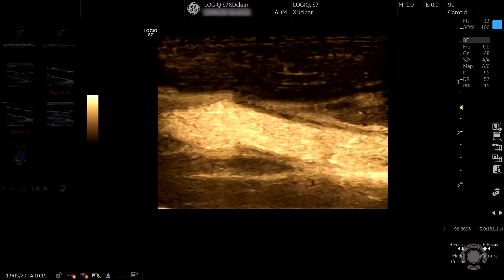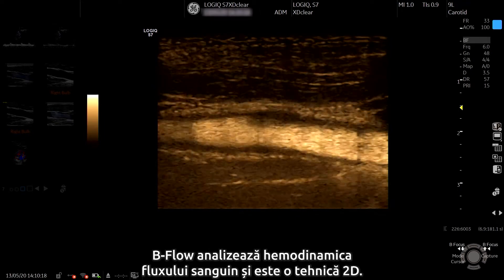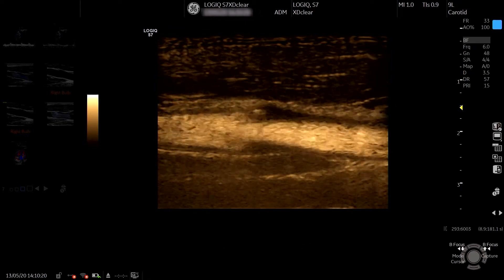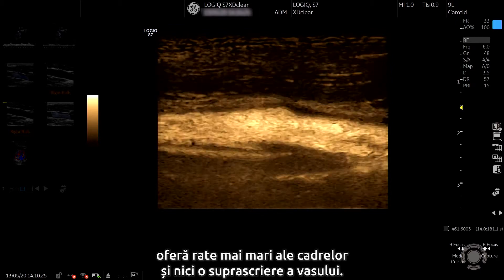We've now added B-flow. B-flow is looking at the haemodynamics of the blood flow and is a 2D technique. This gives no region of interest, higher frame rates and no vessel wall overwriting.